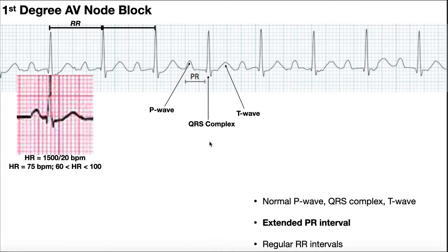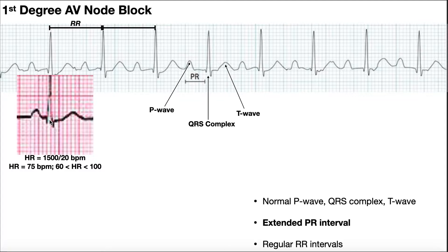How do you know if the PR interval is elongated? The general rule of thumb is that if the PR interval is five boxes or less, it's normal. We can count: one, two, three, four — so this PR interval is about four boxes, which is less than five. That's a normal PR interval.